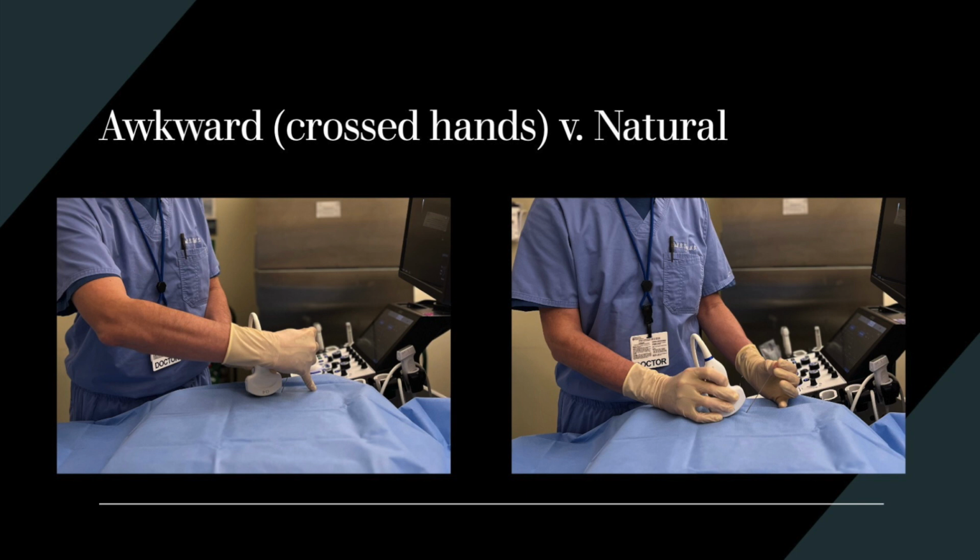But not only does it lead to tension, it also reduces your 3D sense of navigation when you have your hands crossed like that. So on the right-hand image, on the other hand, when you use your left hand to advance the needle, in this case, it's a much more natural position. As you get comfortable using both hands, this will be just as effective for you as using your right hand.